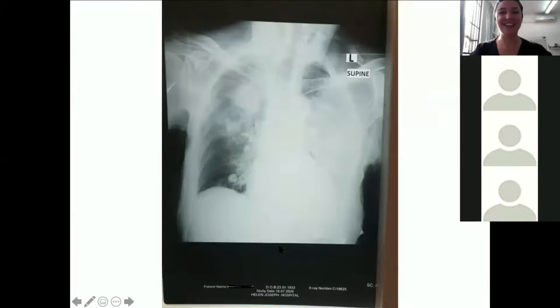Okay, so let's end this and have a look. And it looks like most people have got the right results here. So let's talk you through what we've got. If you have a look at this, can you see in your right upper zones, you've got these areas where you've kind of got circles. This looks like a bit of a circle here. You've got a bigger circle over here. There's definitely something going on, and you've got infiltrates on both sides. But on the right-hand side, it looks like you've got quite well-circumscribed infiltrates. The left-hand side just looks like a complete mess.